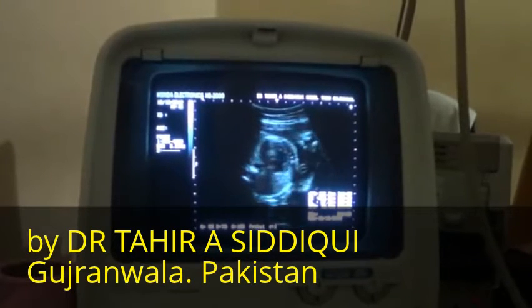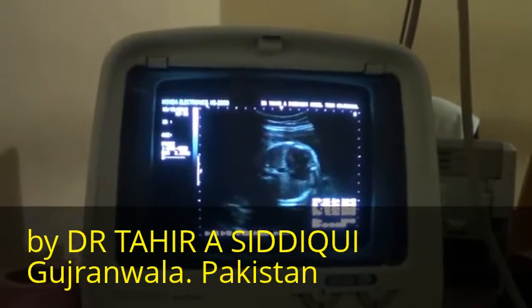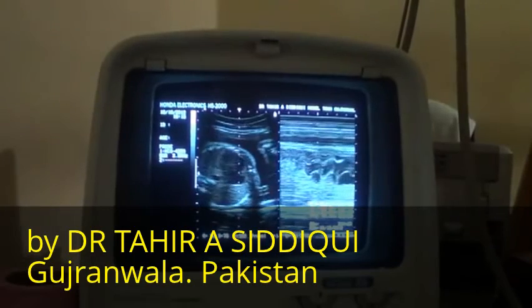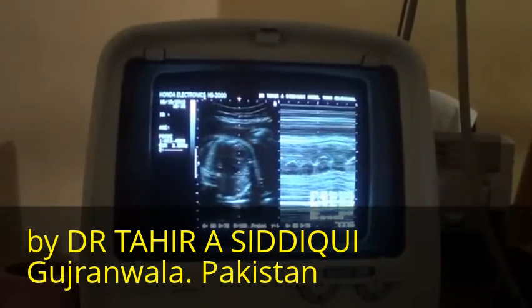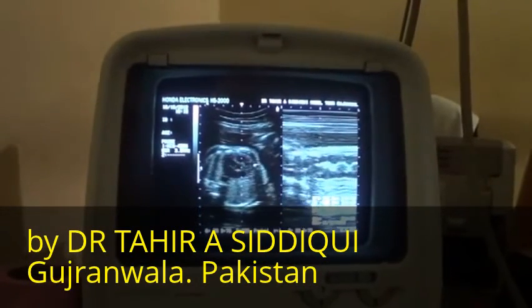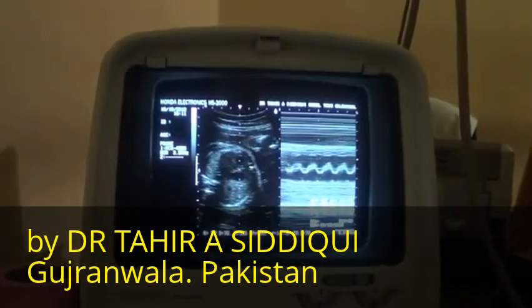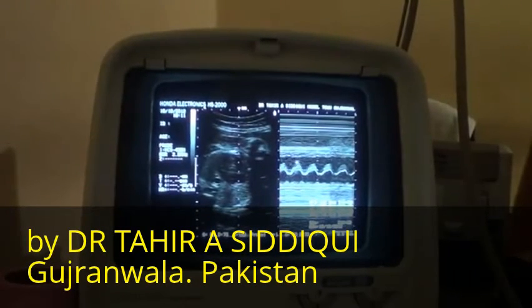The cardiac activity, four-chamber view. It becomes difficult to go along with the fetus when there is polyhydramnios with a hyperactive fetus.